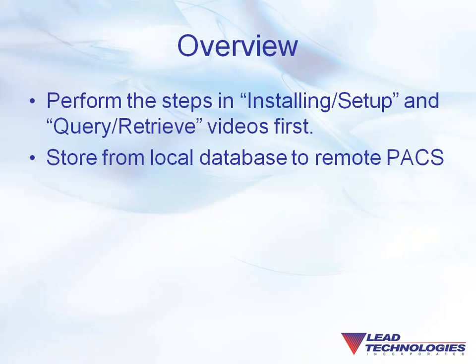In this video, I will show you how to store a data set from the workstation's local database to a remote PACS server.